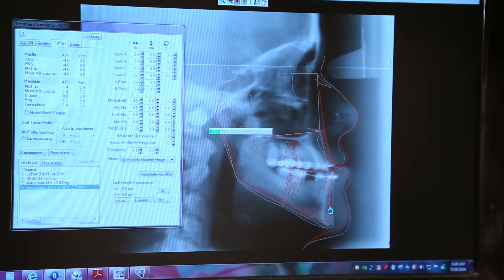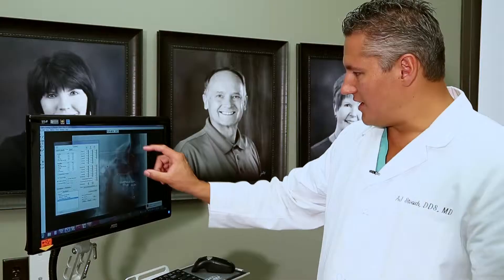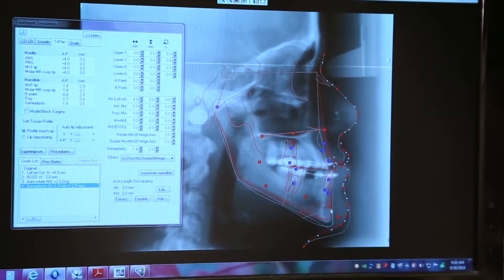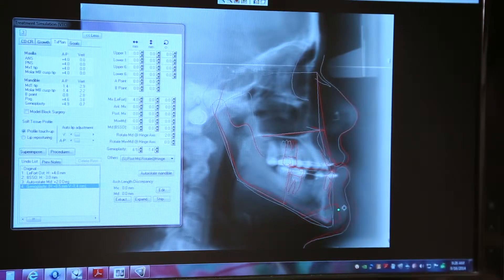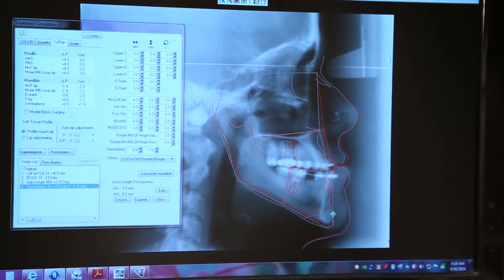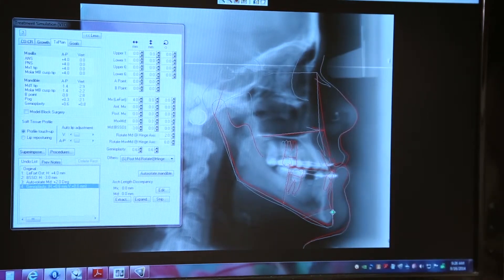By manipulating the chin just a little bit, it creates a nice proportion in the patient's face — it makes a big difference. You can see that I can manipulate the chin in one way or another, and it gives us an idea — as you see this red line moving — where I'm going to manipulate the chin. There are some limitations to this.